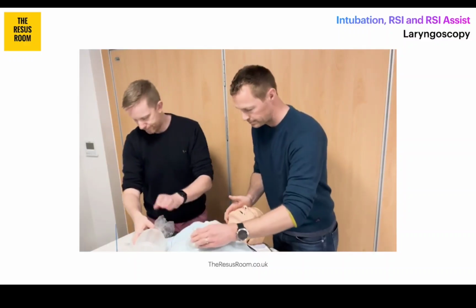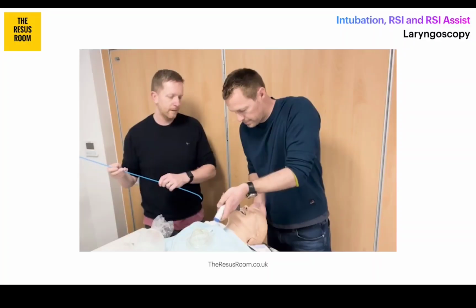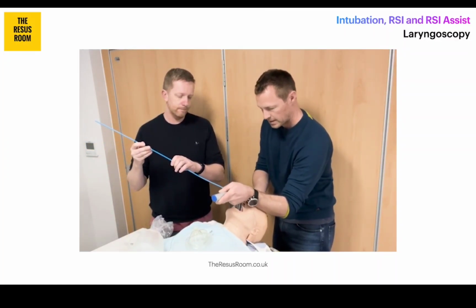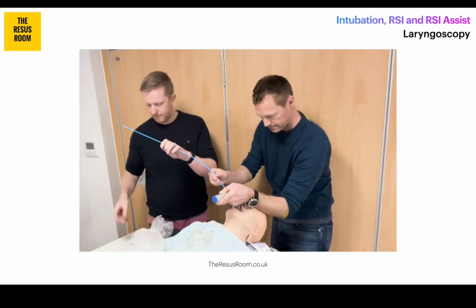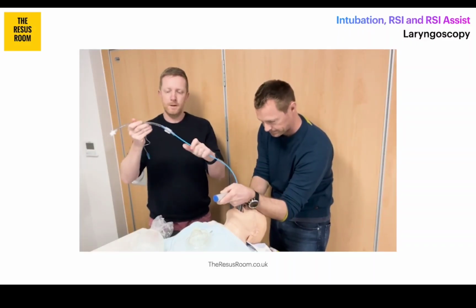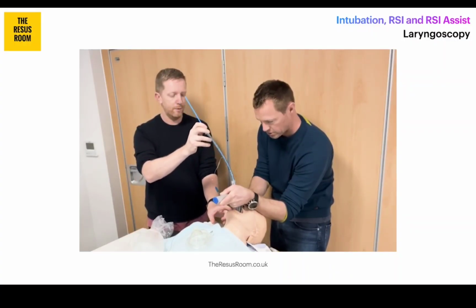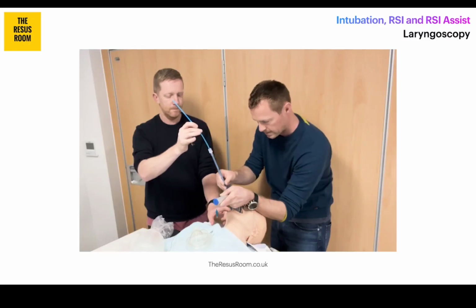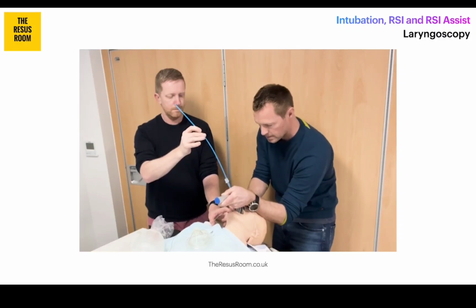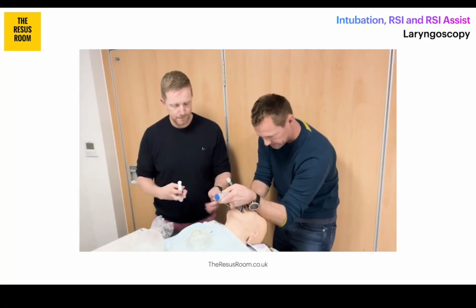It's worth having a look at that externally again. So again, direct laryngoscopy. So operator 1 takes the blade, puts it into the right side of the mouth, sweeps the tongue over the left to create some space. Then they're going to creep down to find the epiglottis. Then they're going to lift the epiglottis to reveal the larynx. Then the tube goes onto the bougie, an exchange of the tube for the bougie between operators. Down comes the tube through the cords, rotated through the cords, passed through to the right distance. Then the bougie comes out when operator 1's happy. Then it's going to be air into the cuff.